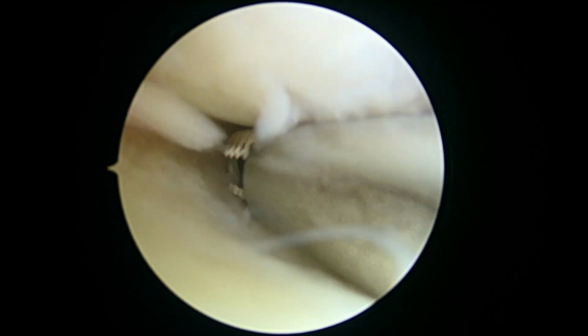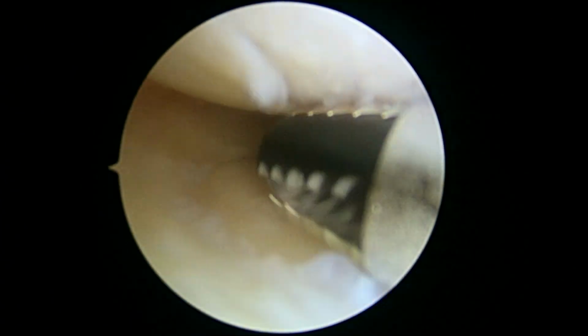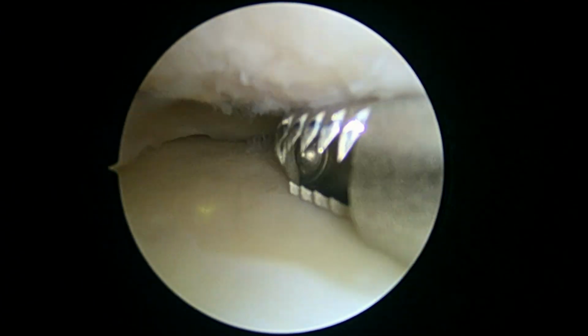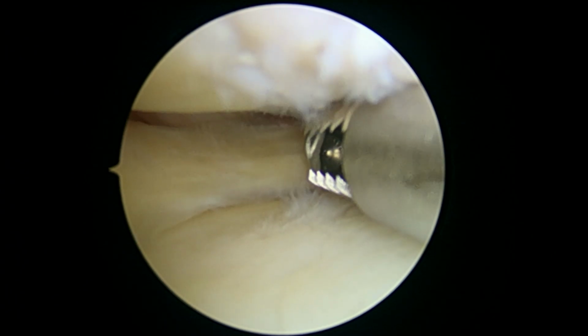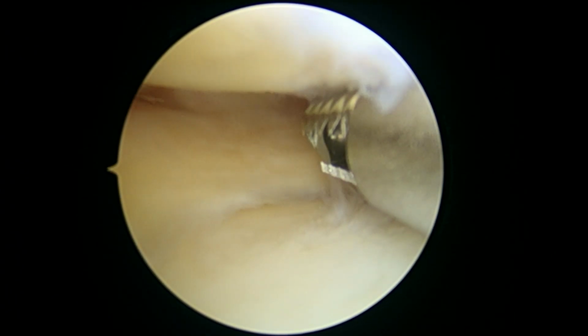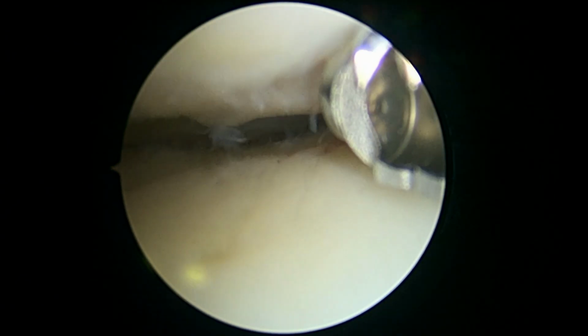Okay, so here you've got a little bit more meniscal fraying on the lateral meniscus, and a little bit more loss of cartilage on the femoral condyle up above and on the tibial plateau down below as you look down here. So far, no additional loose bodies have been seen.